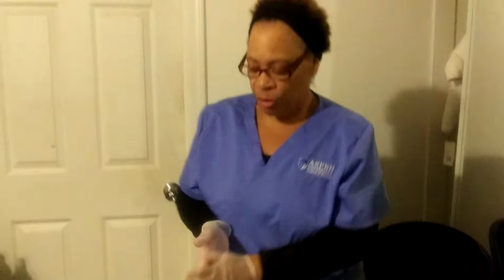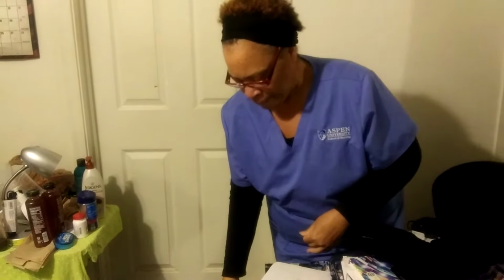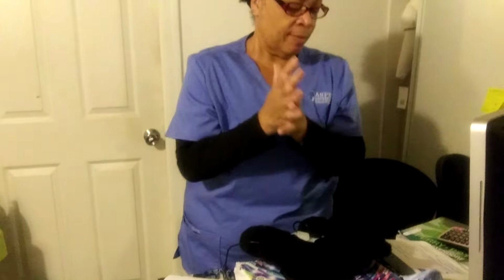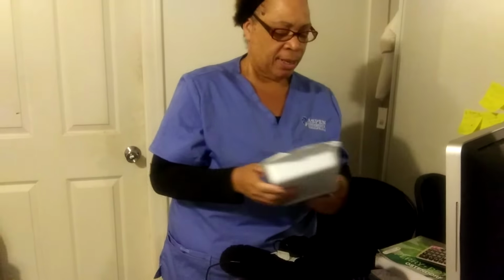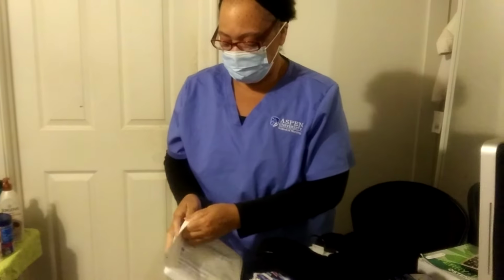Okay, then I discard that, remove my gloves, wash my hands again. I get my kit. I also would put on a mask. I get my sterile kit. And I have the patient sitting upward, and I also ask them to turn their face sideward as I get ready, as I do the procedure.